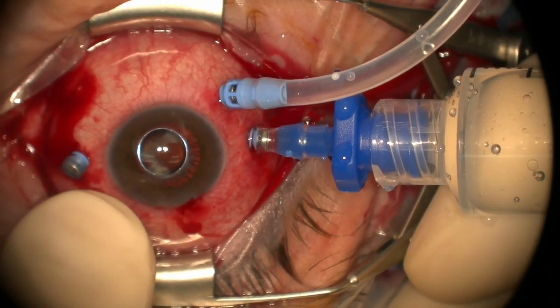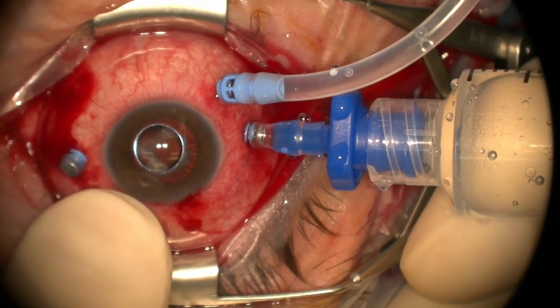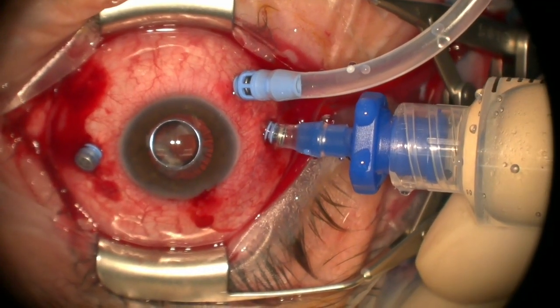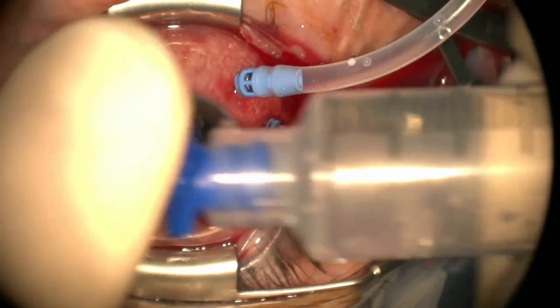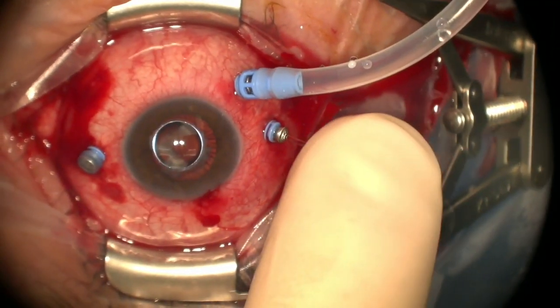And there it is, it just got real soft real quick. So I stop immediately, kind of recenter ourselves a little bit. Nope, that's about all we're gonna get. So I'm gonna pull this off. You see the oil, the water freely flowing out. You can see our syringe there.